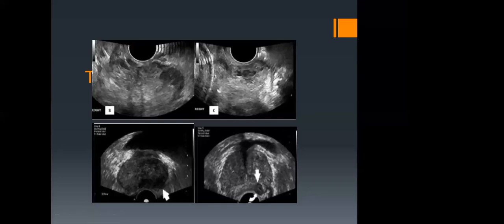Now, again, if you're going to do a biopsy, it is difficult for you to discern. You can see this is a peripheral zone. We said it is difficult for you to tell the zones. But when you're going to do a biopsy, especially for the radiologist or for the physician, if the urologist is going to work with you, the sonographer or the imaging technologist, tell him or her the approach is transrectal. Because like we have said, most of the lesions are in the peripheral zone, it is easier.